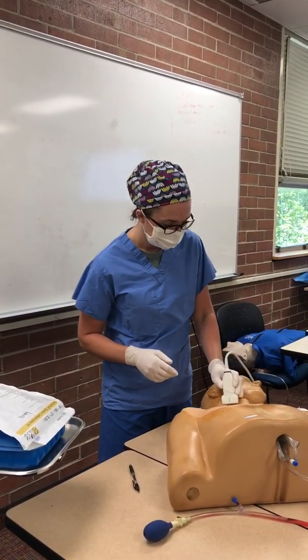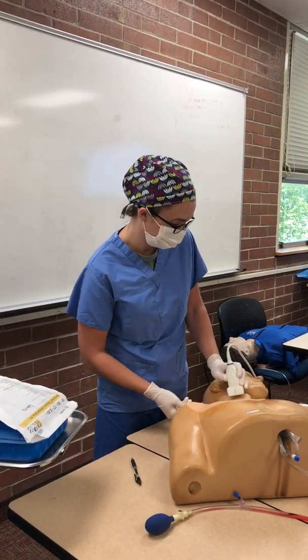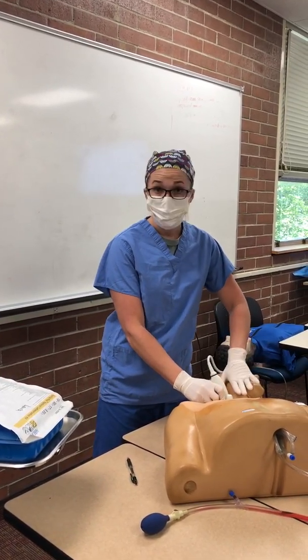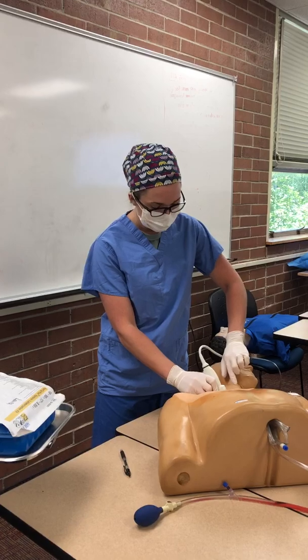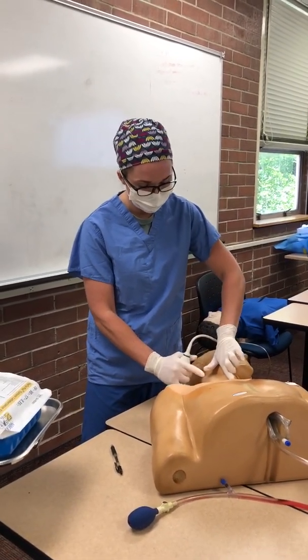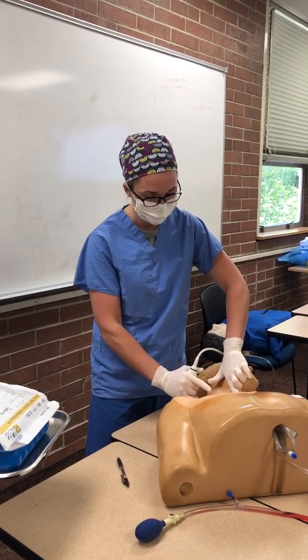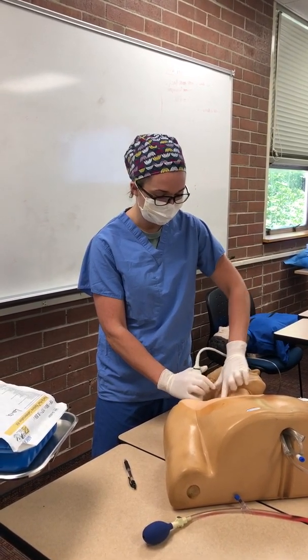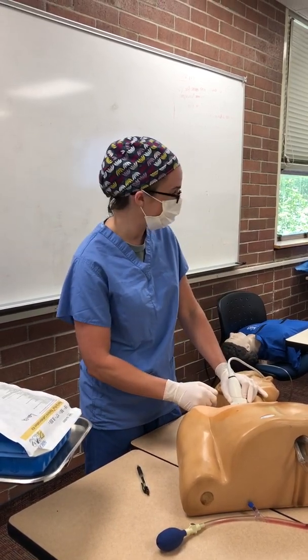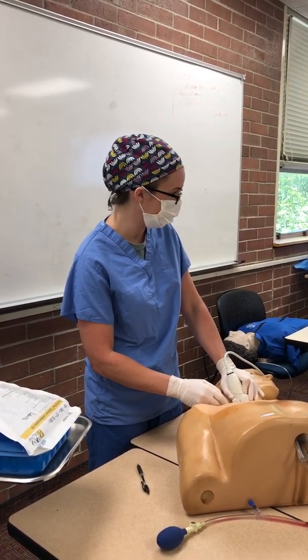So looking at his ultrasound here, I'd start right at the clavicle. Just general landmarks that I'm looking at, I would expect it to be across from about C6 or the cricoid cartilage, in between the sternal branch of the sternocleidomastoid and the clavicular branch. But again, I'm going to use my ultrasound just to identify that. So I'll start down at the clavicle and I would sweep up.